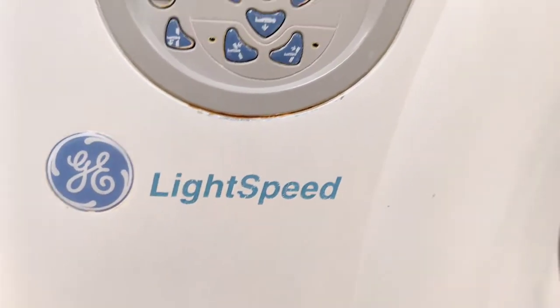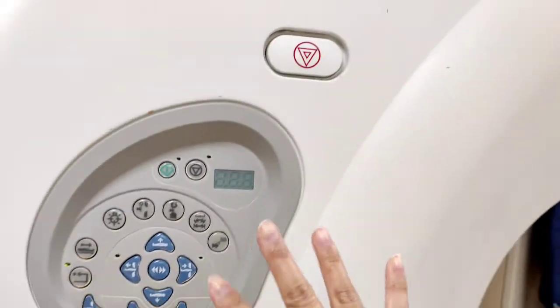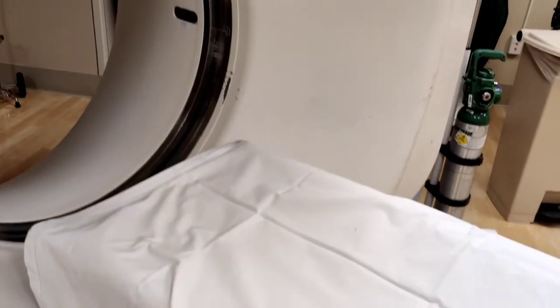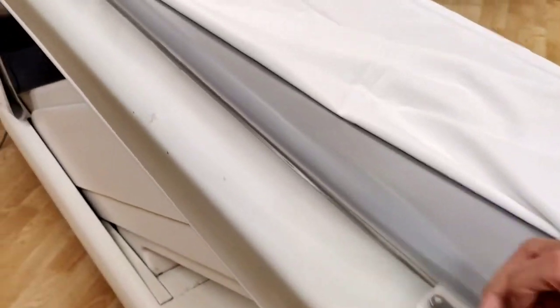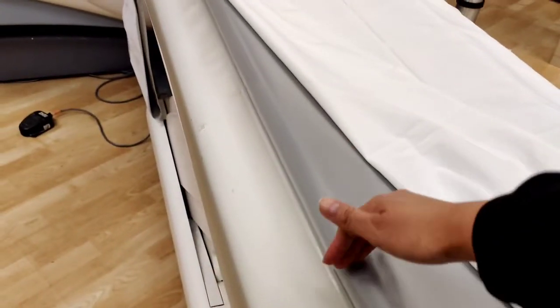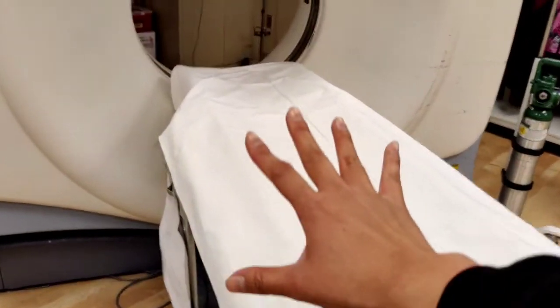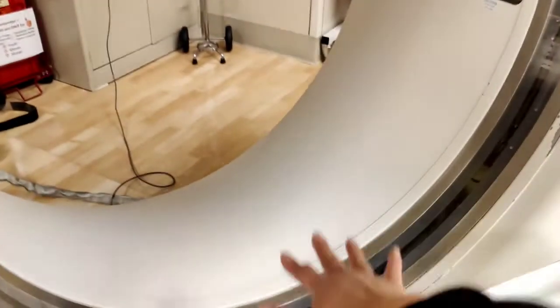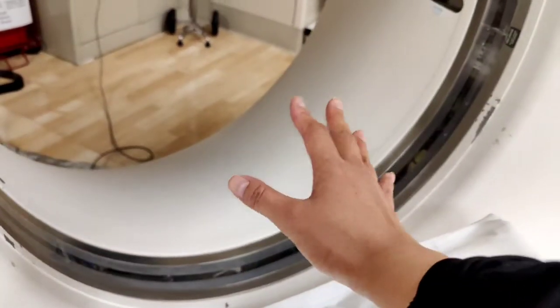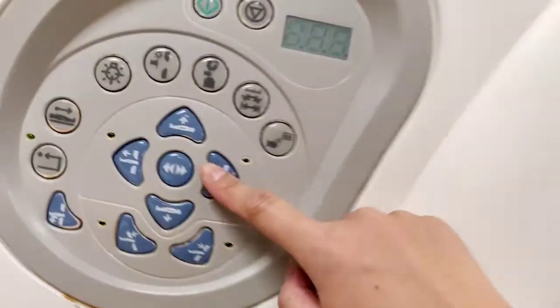Hey guys, welcome back. Here is the GE machine. I wanted to go through some of the buttons and numbers. Just before we begin, know that with the GE machine there is no line indication — at least this one — to tell us how far off we can scan, like the end of the table or the end of the scan line. Usually machines will have some type of indication on the table or a line somewhere. So with this, it's very good to just push the patient all the way down. If they have a chest-down pelvis, their feet can hang off the table — that's fine. Just scoot them all the way down so that nothing will show up red when you're scanning the patient.